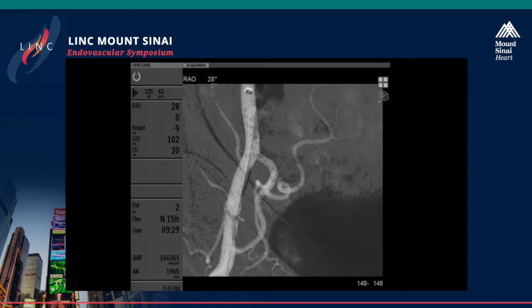And the second thing is, when we do directional atherectomy, I'm curious about Dr. Zeller and Dr. Rumbach's comments. If you do have a dissection in this area, what would you do here? So we're just going to start doing directional atherectomy with the Silverhawk. Just for the audience, we put a distal protection device with a filter in the SFA. And don't ask me why we didn't protect the profunda. We chose the SFA, and I don't know whether there's a right or a wrong. We're just going to go ahead and get started while you guys discuss.